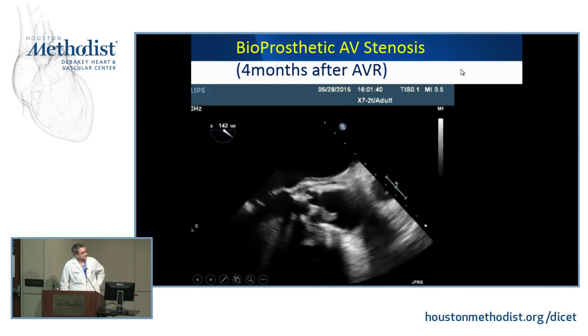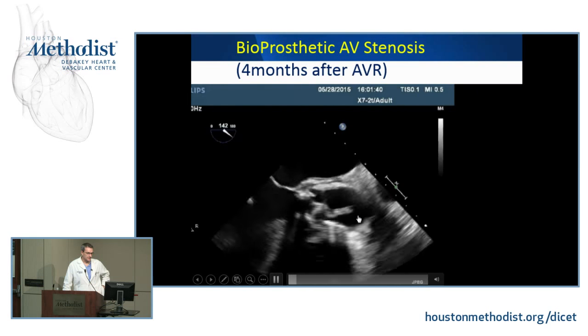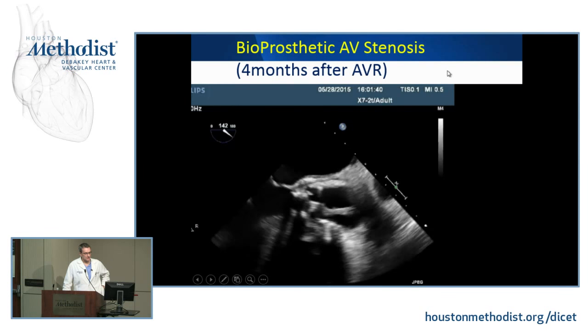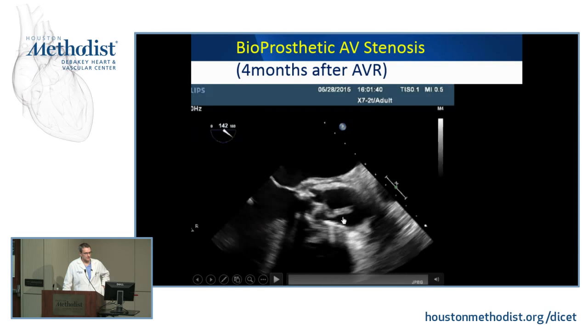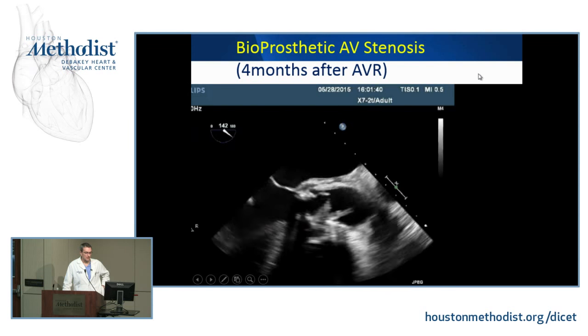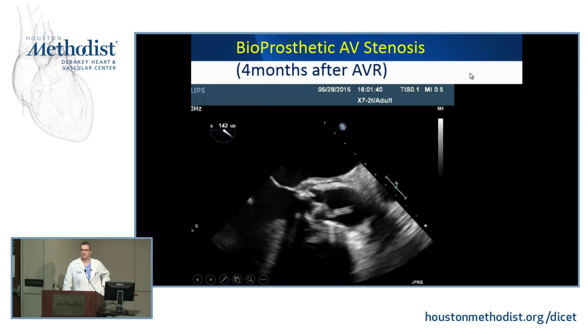Different case. This is 4 months after a surgical AVR. And you see this thing, and that's not subtle. Now this is interesting. So this case, I believe, is the one. Again, it's sort of oscillating, it's attached. Could that be thrombus? It's possible, but it's a very high flow state on the distal side of a bioprosthetic valve. Those are high velocities. You'd probably have to have a very unusual hematologic state to really get a thrombus there.